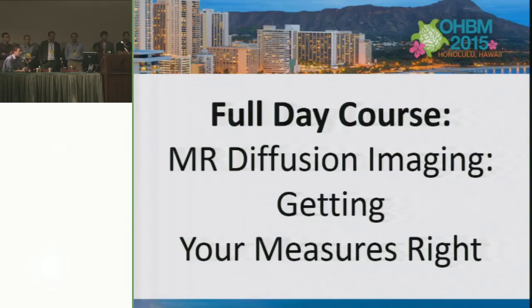If you study a highly moving group of people, like ADHD children or elderly adults, you probably want to err on the side of removing gradients and not subjects. Sure. But the point is, as soon as you remove gradients, you keep some subjects with 30, 35 directions and some subjects with only 20. So in terms of statistical stability, you're going to have some effect. That's why you want to balance depending on how your data is.